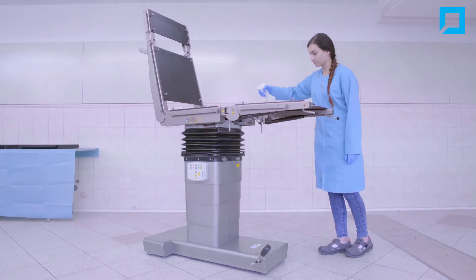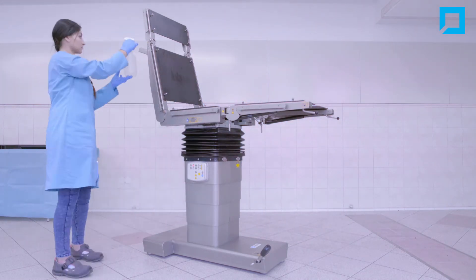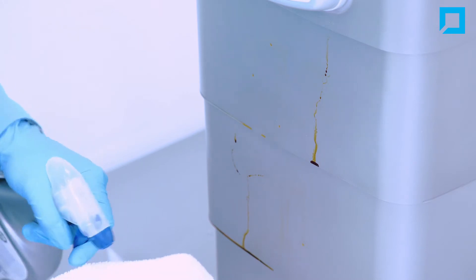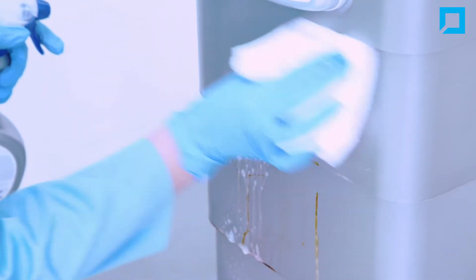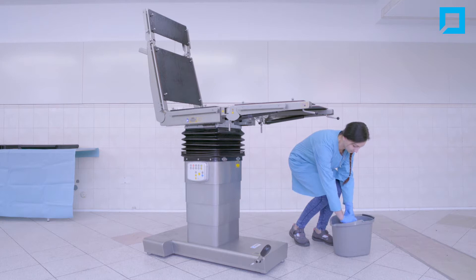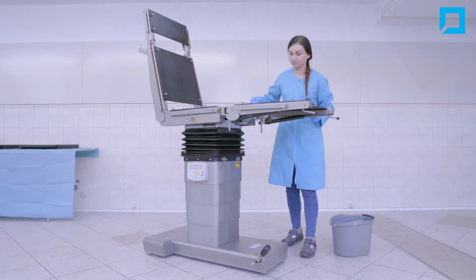Disinfect the table surface. During disinfection, do not allow the moving parts inside the table to come into contact. In case of steel discoloration, use a stainless steel cleaner. Wash the disinfectant thoroughly from the surface of the table with a damp cloth.